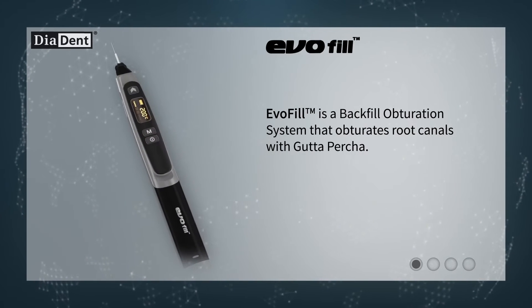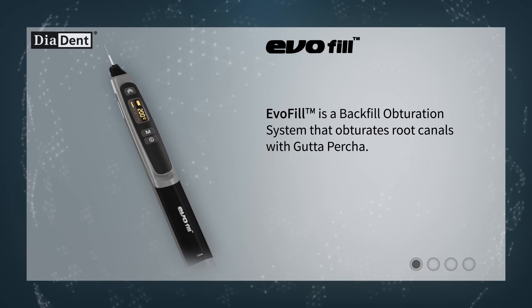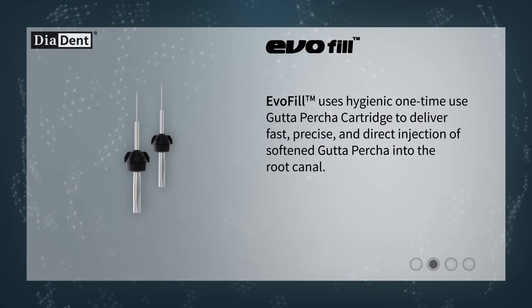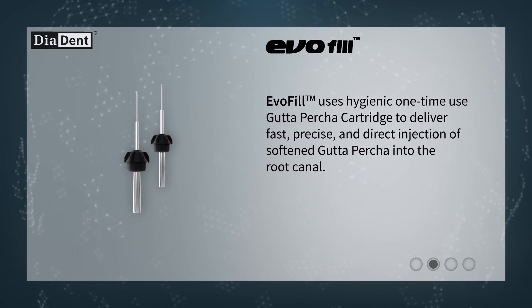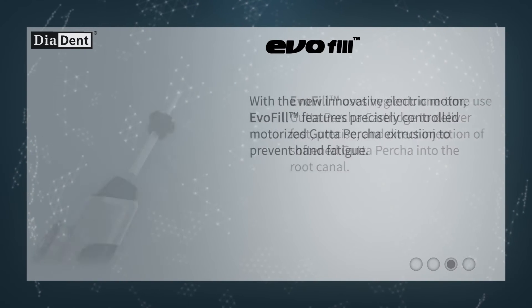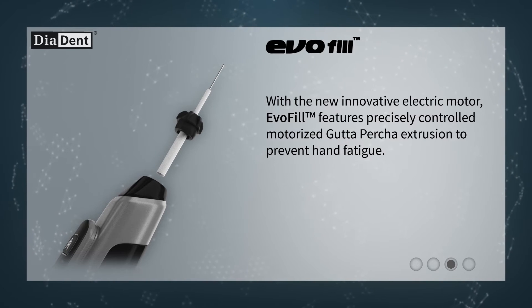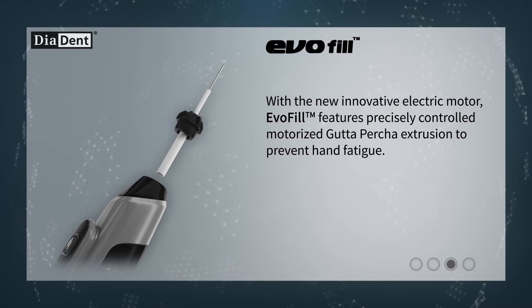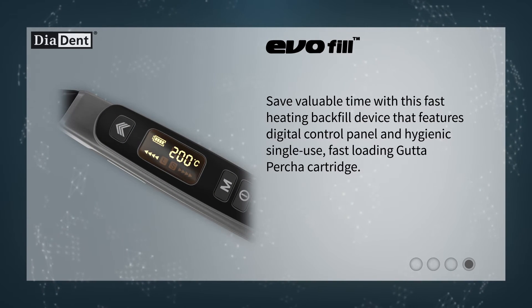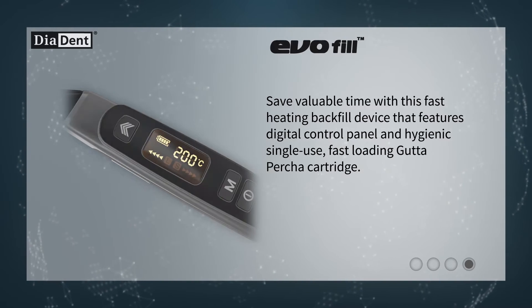Evofill is a backfill obturation system that obturates root canals with gutta-percha. Evofill uses a hygienic one-time-use gutta-percha cartridge to deliver fast, precise, and direct injection of softened gutta-percha into the root canal. With the new innovative electric motor, Evofill features precisely controlled motorized gutta-percha extrusion to prevent hand fatigue. Save valuable time with this fast-heating backfill device that features a digital control panel and hygienic single-use fast-loading gutta-percha cartridge.